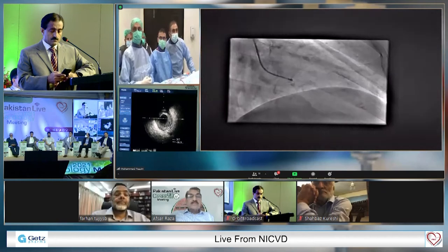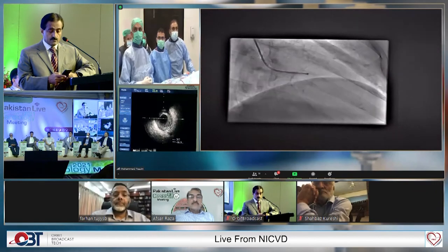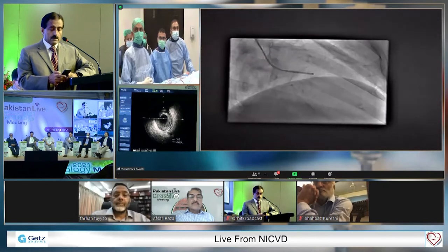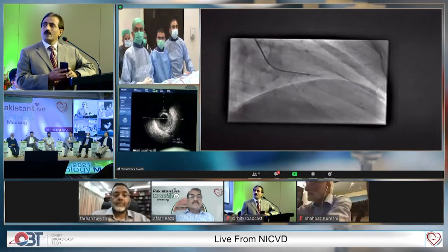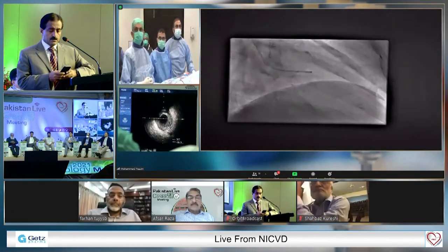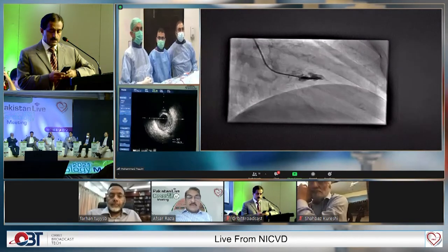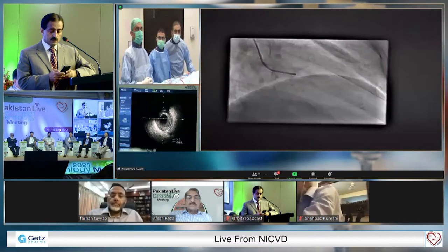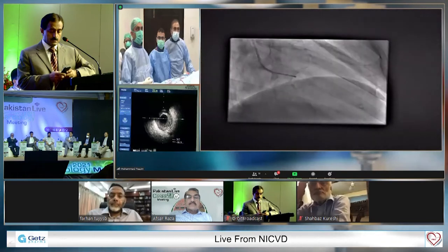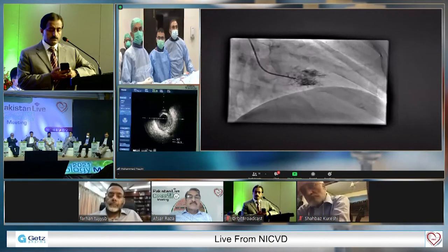This case is that of a 50-year-old gentleman. He is hypertensive and overweight. He presented to our ER, emergency department, with a history of chest pain for 2 hours. The ECG was consistent with an inferior wall MI. We gave the patient dual antiplatelets in the ER per the initial protocol. The patient was vitally stable, and we took the patient within 25 minutes to the cath lab. I'm going to show you the recorded scene.